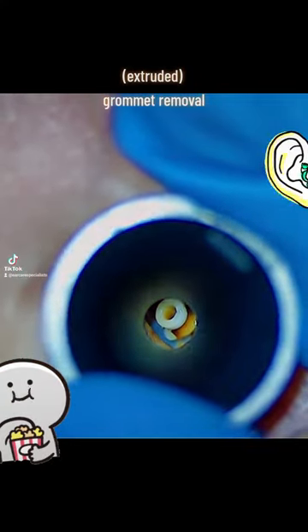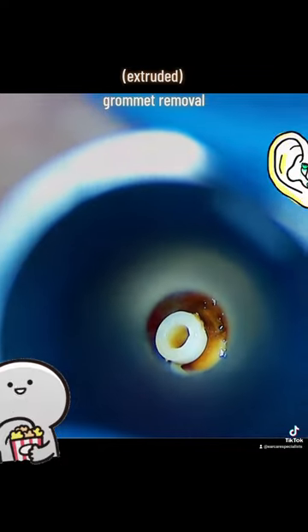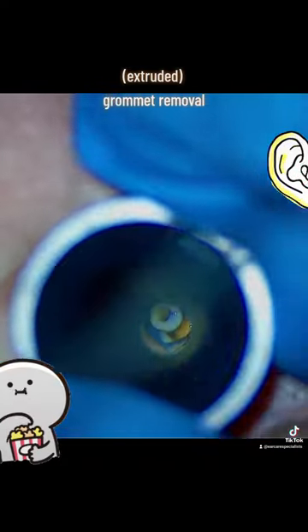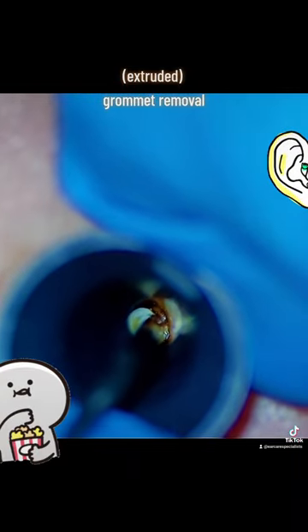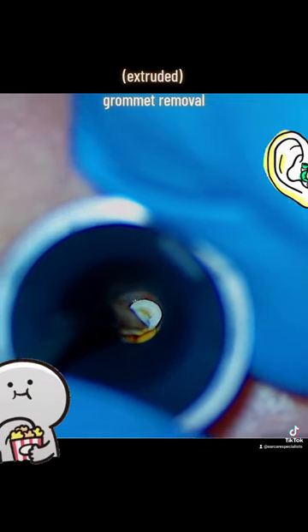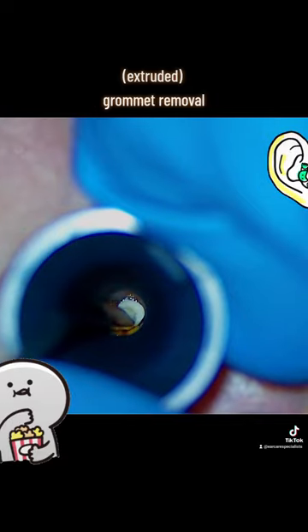Quite a common surgical strategy in young children with chronic glue ear, but this is an adult hearing aid user, and I've monitored it over time, and eventually what happens is as the eardrum starts to heal, it just pushes the grommet out of there. The eardrum heals over completely and the grommet is just left redundant in the ear canal.